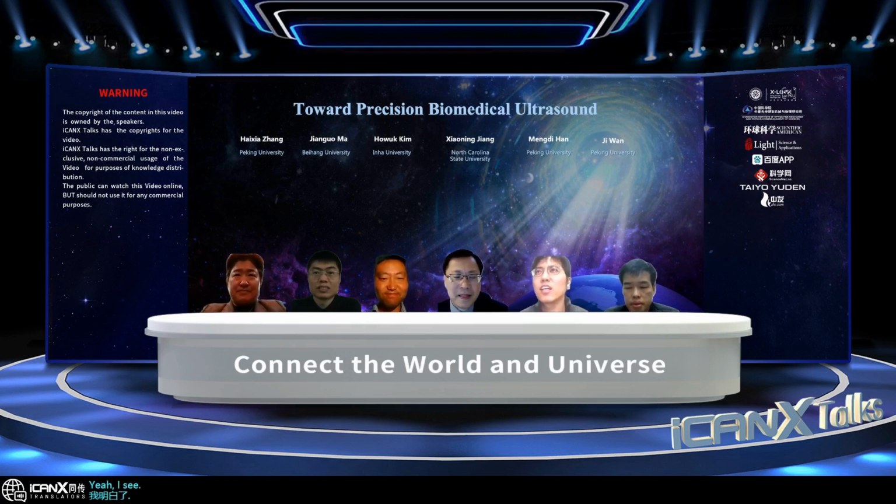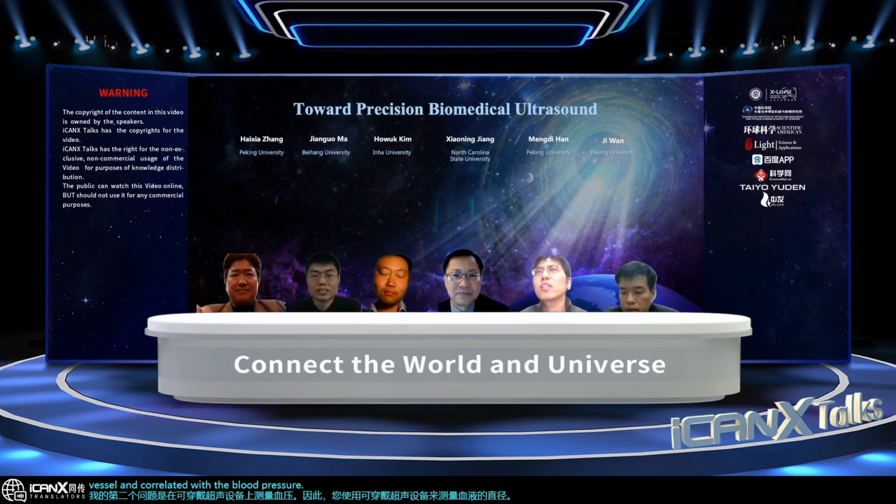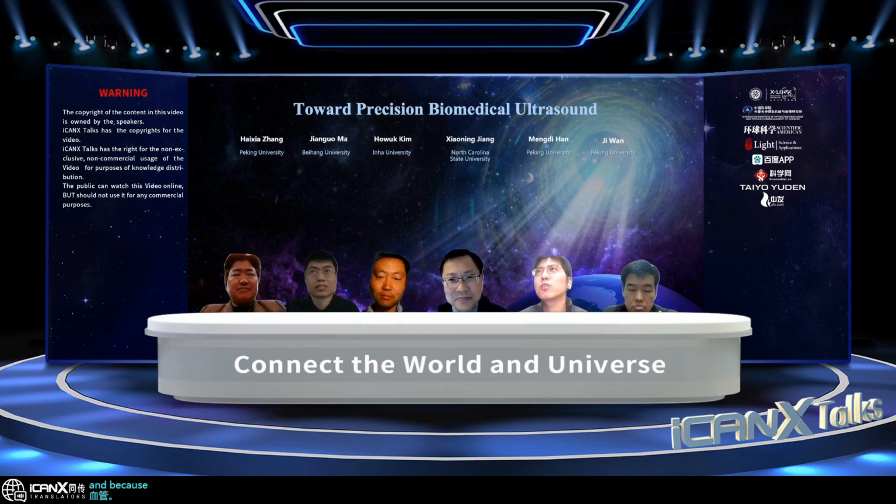Yeah, I see. My second question is on the wearable ultrasound device to measure blood pressure. You use the wearable ultrasound device to measure the diameter of the blood vessel and correlate it with the blood pressure. So I'm wondering if the correlation also depends on the thickness and the modulus of the wall of the blood vessel. Because if you use ultrasound, you can also use the Doppler effect to measure the blood flow and correlate the blood flow with blood pressure. So can you compare these two approaches?